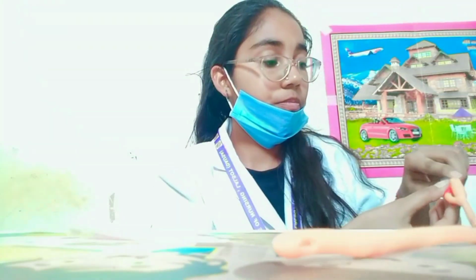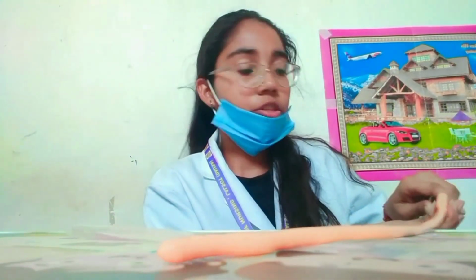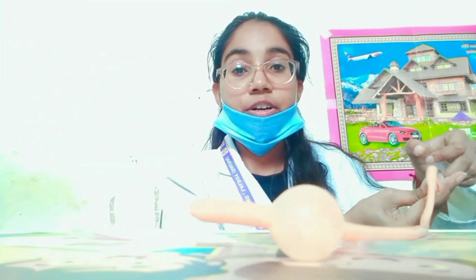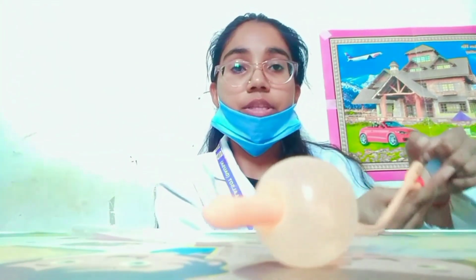You see here. And one thing is that after inflation of the balloon, you just pull the catheter backward to check that the catheter is secured or not. Then okay, so now I instilled water into the inflation valve and you see here the balloon is inflated. Okay, just like that the balloon is inflated to secure in place within the urinary bladder.